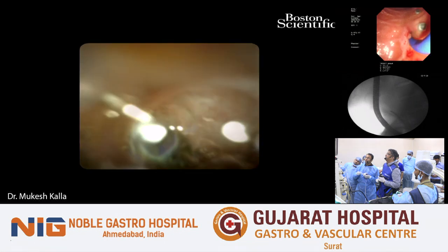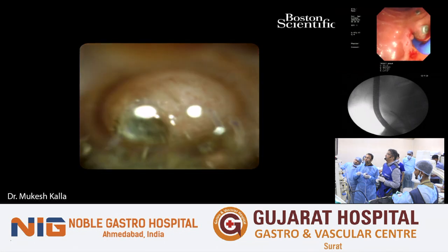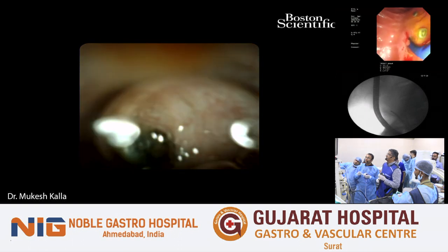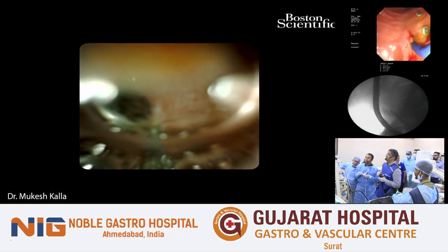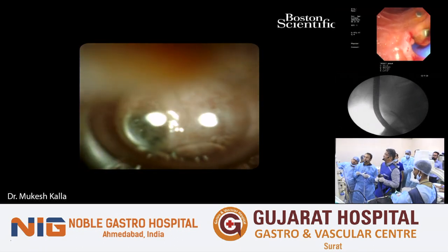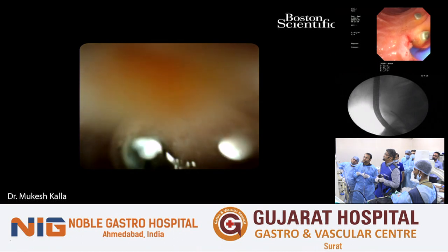The Olympus probe does not have a high quality image, and therefore it has never gained popularity, and I've not personally used it. Yeah, and to my knowledge, Saurabh, it only has right-left movement. It doesn't have up-down movement. Yeah, it's like a bronchoscope.